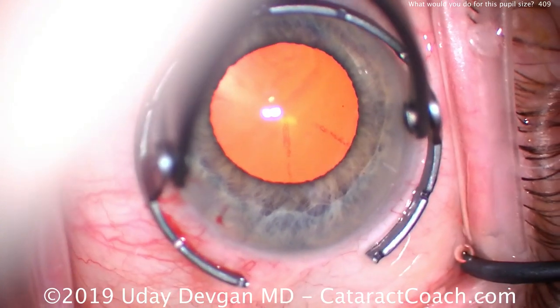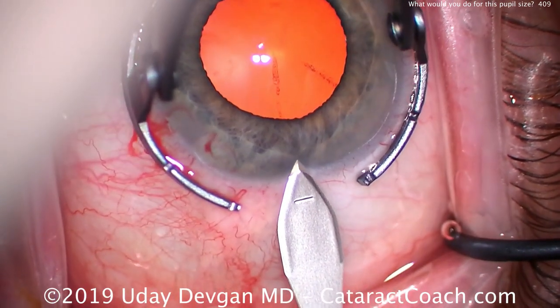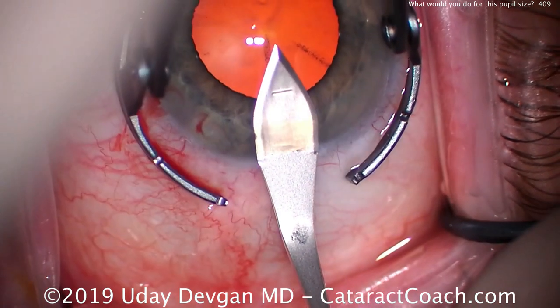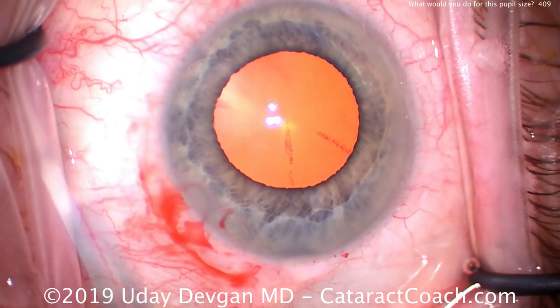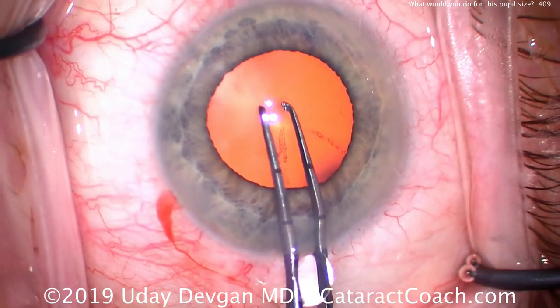Now we'll make our main incision. It's important that we make a good incision here. We don't want to have a short incision or a poorly placed incision, because that may make the iris prolapse worse. And now it's time for our capsulorhexis — you can tell I'm not going to use hooks or rings or other devices.